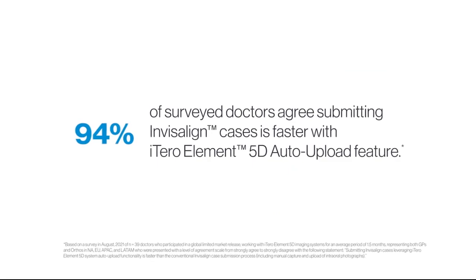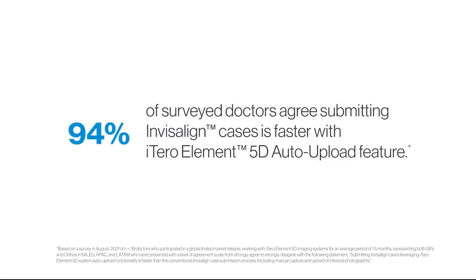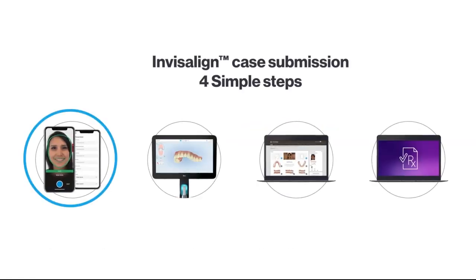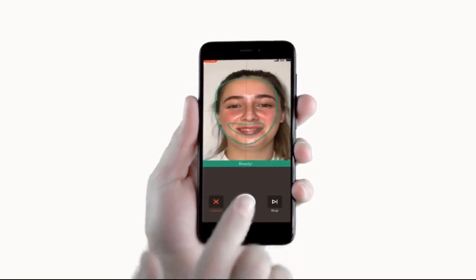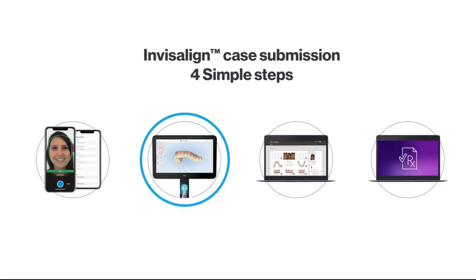94% of surveyed doctors agree submitting Invisalign cases is faster with iTero Element 5D Auto Upload, saving an estimated 10 minutes per case. Submitting Invisalign is streamlined to just 4 simple steps. Take photos using the Invisalign Practice app. Scan the patient.